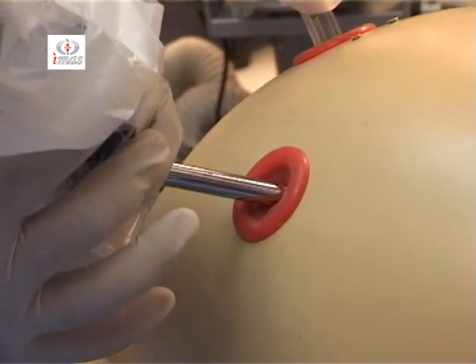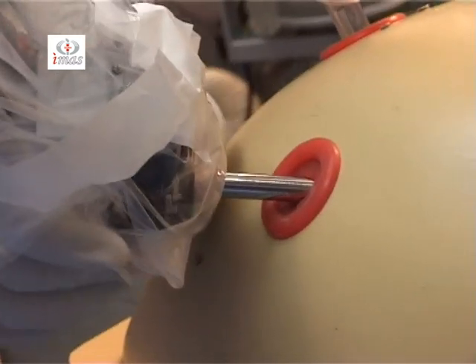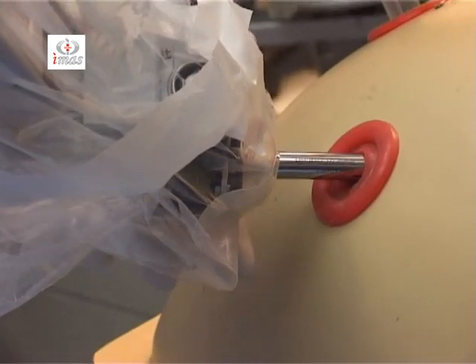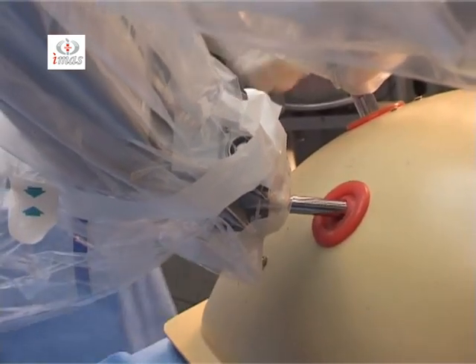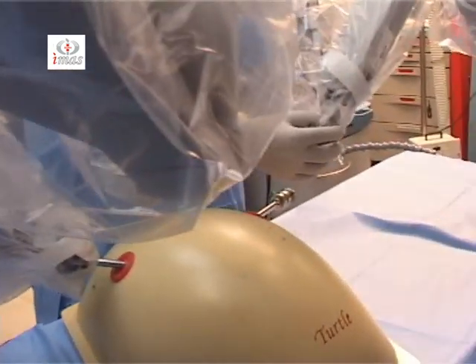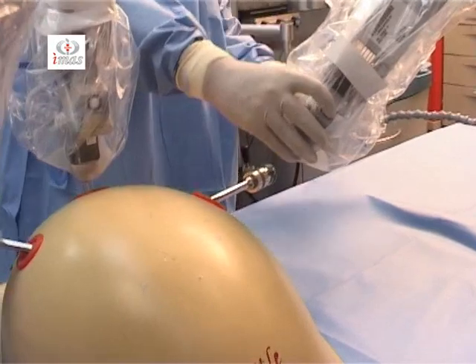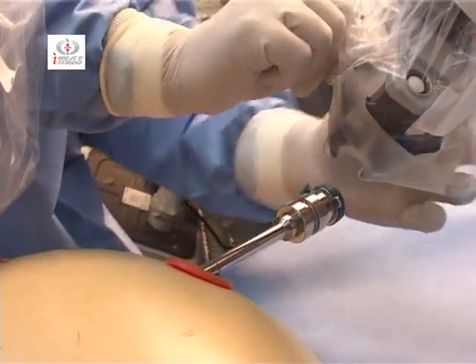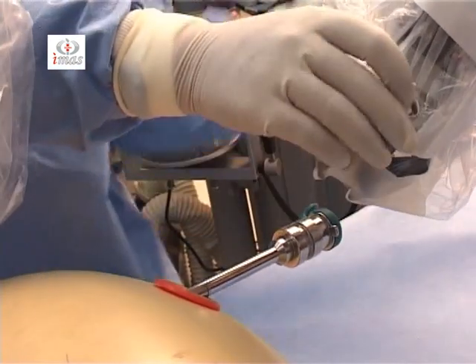Now you have to make it parallel. Take it inside the clip and lock it. This arm is also docked. Dock the third arm again. R3 is made parallel to the port. The draping is checked whether it is draped correctly or not.